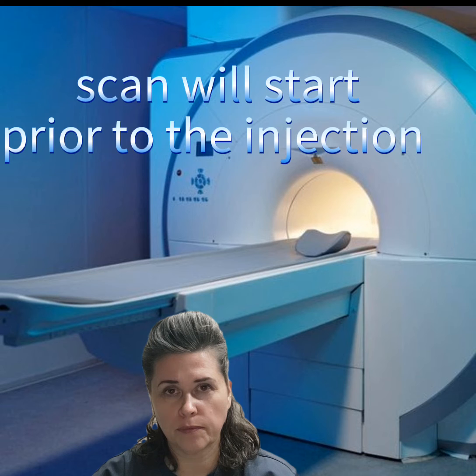Patient again positioned supine on the back, head first. Laser landmark also 1-2 inches below the chin. There's one specific thing about it also, that we have to time our injection. For that purpose, we will use a power injector. And again, we have to be ready. The patient has to be ready.